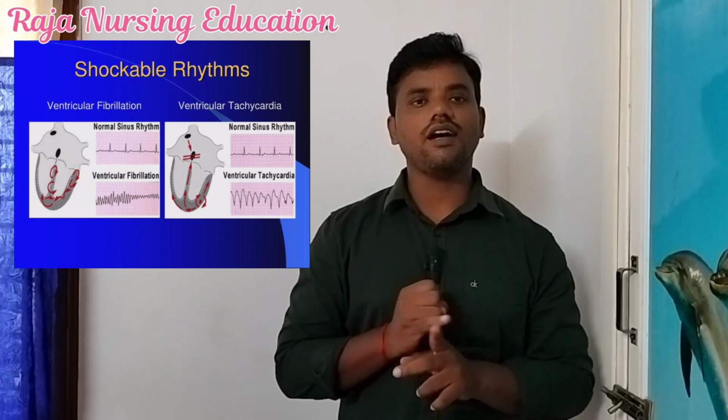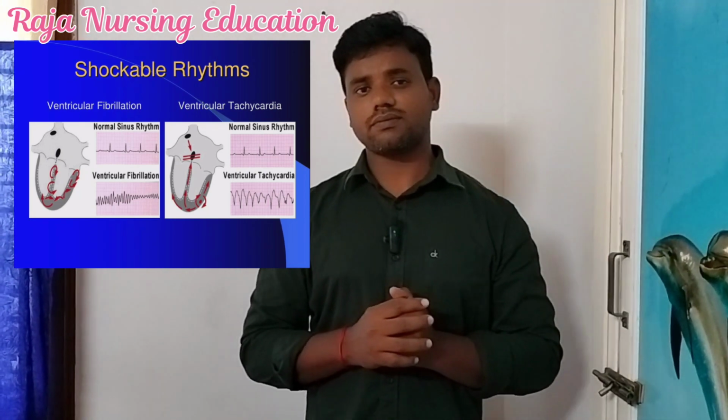In this video, we are going to discuss defibrillation. What is defibrillation? As a nurse, if you are a health worker, you all know about the defibrillator. It's a device used in case of cardiac arrest to deliver a shock to the patient to restore the normal heart rhythm. There are only two main conditions where we can use defibrillation: one is ventricular tachycardia and the other is ventricular fibrillation. Only in these two rhythms can we use defibrillation.